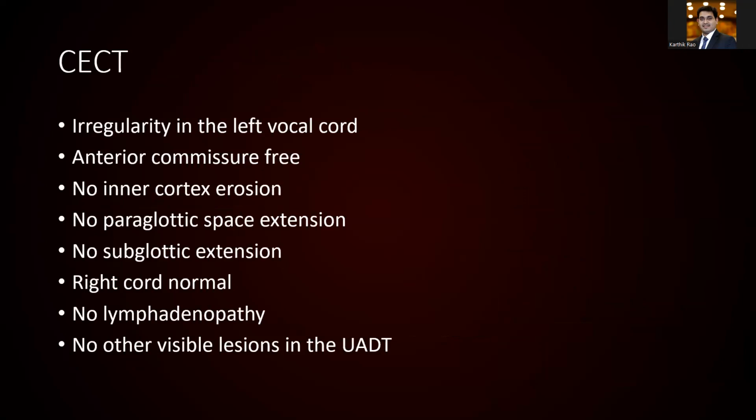First we would like to understand what the lesion is which is present in the patient. Then only we would like to subject that patient to scopy, to understand the anatomy properly. Just before taking the patient into OT, we should know exactly where the pathology is and what the extent of the disease is, so we'll have a clear idea of what we are dealing with. And also, not in this particular scenario, but in other patients with, say, for example, hypopharyngeal malignancies. Stay with the larynx now.